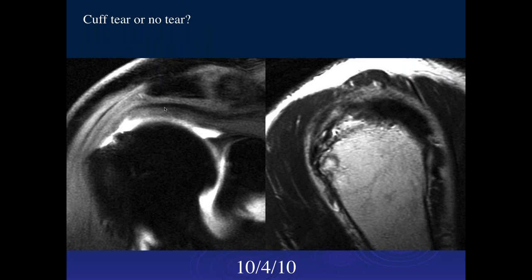Looking at more views from the same date — it looks very similar. Now notice that the musculotendinous junction is proximally retracted to the glenoid, and this distance is about two centimeters. So if you look at this, it appears there is proximal retraction. How could you get retraction if it's just a partial tear?